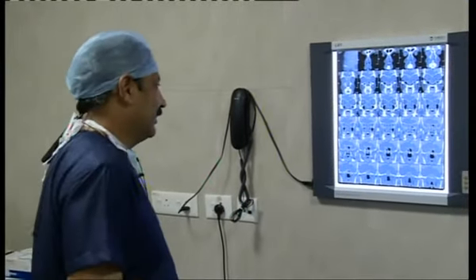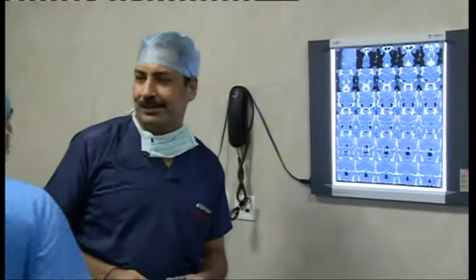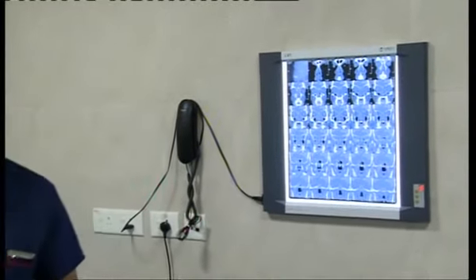So in this course, we are going to introduce a concept of a rapid CT reading. Of course, these guys can read a CT for the whole day, one single CT. But what do we necessarily need to know in terms of the surgery that we are doing? The bare essentials is also something which we should cover.